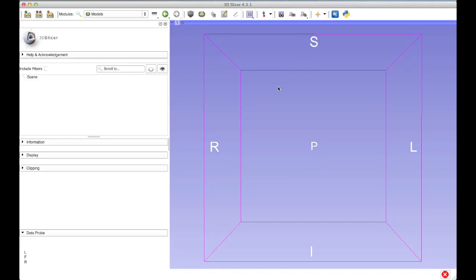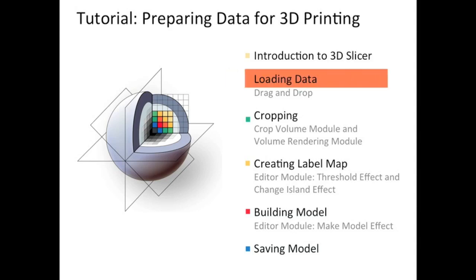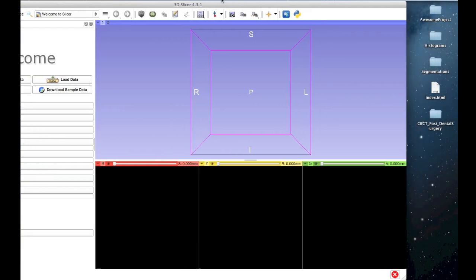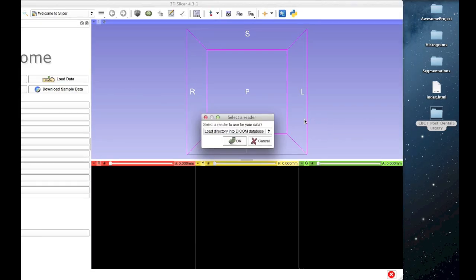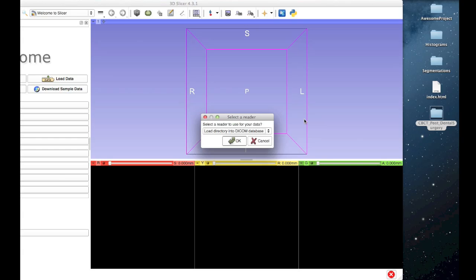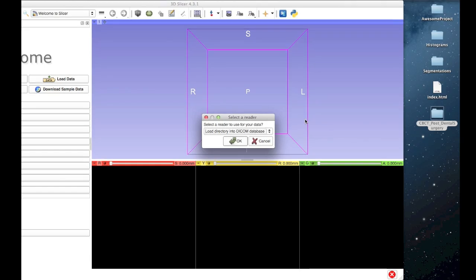Now we're ready to begin loading our data. I'm going to use drag and drop to load my cone beam CT, which really is the simplest and most intuitive way to load your data into Slicer. I've saved my DICOM directory to my desktop, so I'm going to begin by locating that — cone beam CT post dental surgery. I'll click and drag the whole folder into the Slicer window. Your file doesn't have to be saved to your desktop; you can locate it wherever it happens to be and click and drag it straight from that directory. It also doesn't have to be a DICOM folder — you can click and drag other file types into the Slicer window as well.